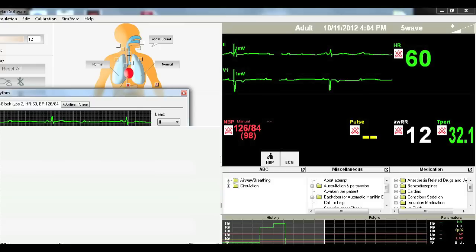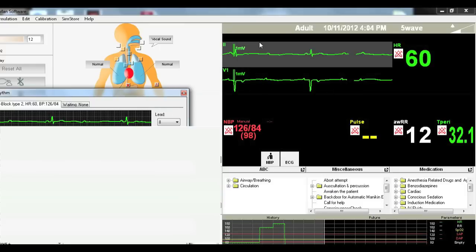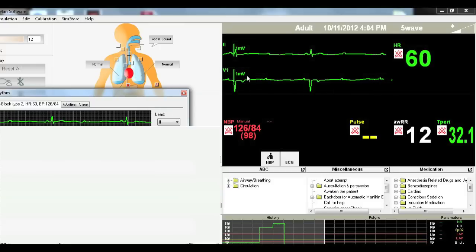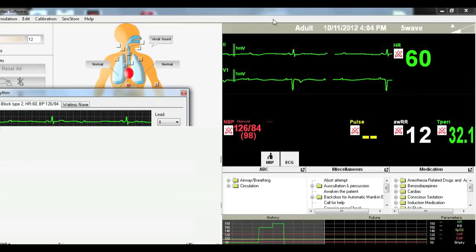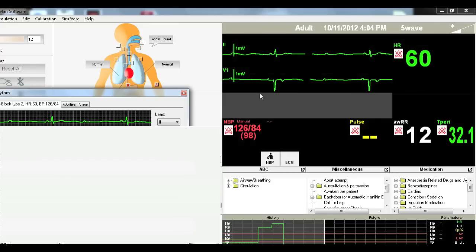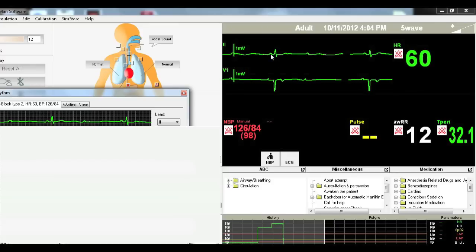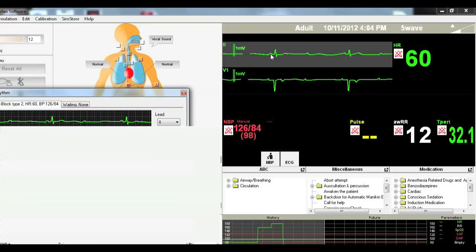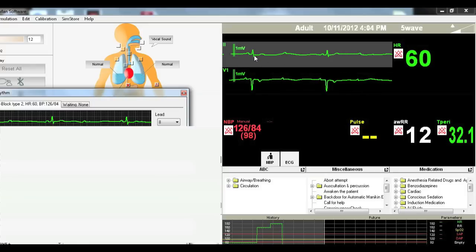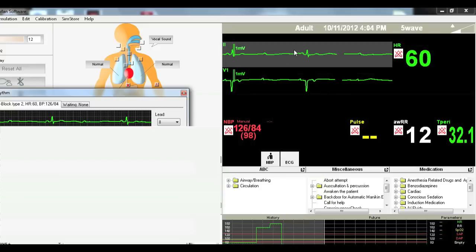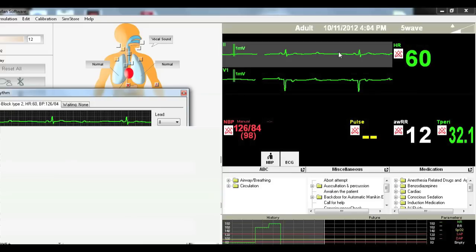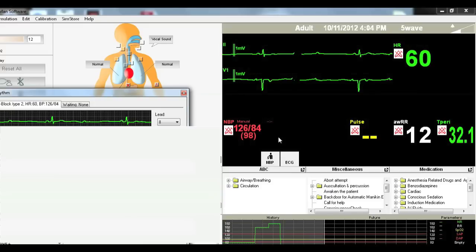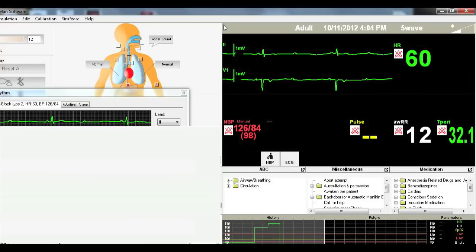So this is a second degree AV block type 2. And this is characterized by you have random P waves that are not followed by QRS waves. And you have P waves that are followed by QRS waves, but the PR interval does not increase. It is the same. So you can see here this PR interval is the same as this PR interval. But then you also have that P wave that's right there. And you have another one that's here that's not followed by a QRS complex. So that is a second degree type 2 AV block.